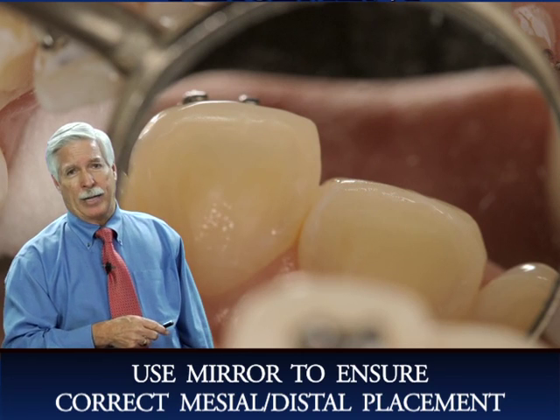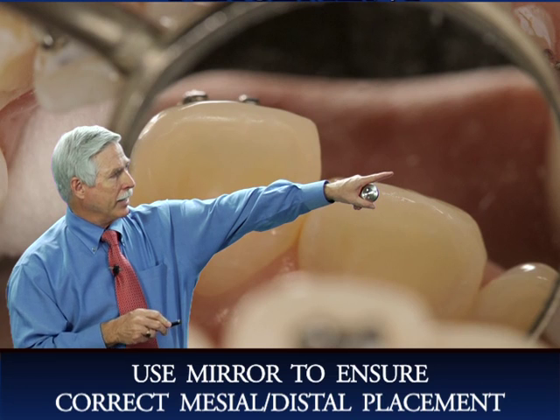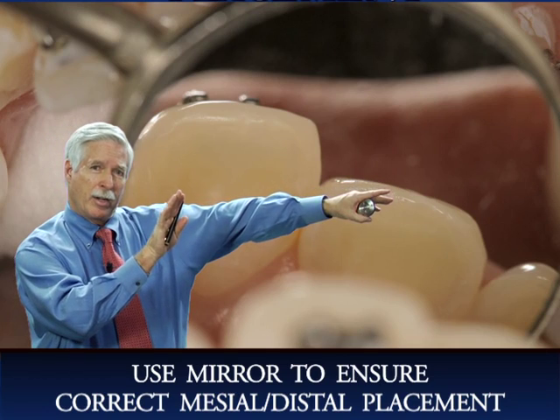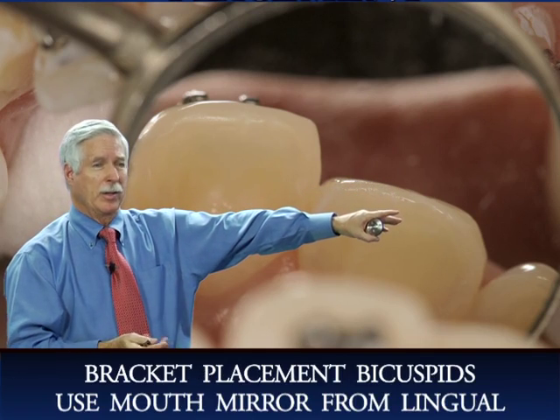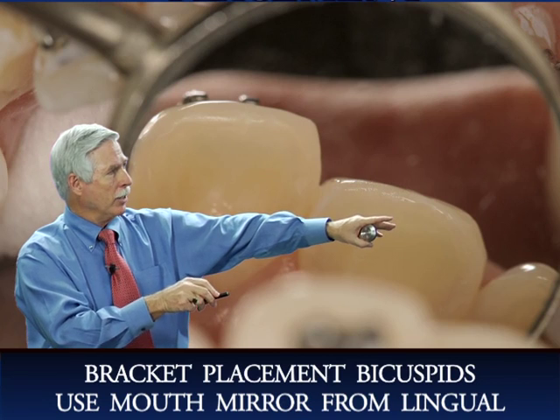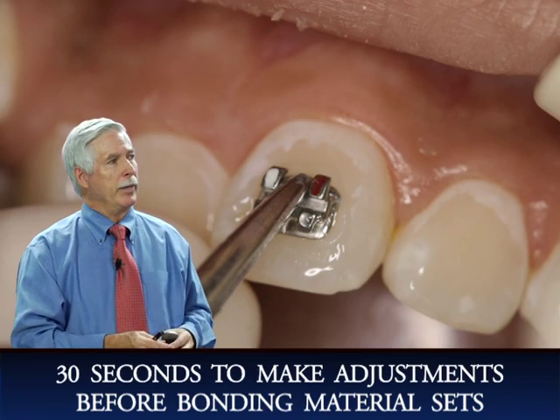When you're placing brackets, it's a good idea to take out your mouth mirror, as you see here, and just check to see if the bracket is lined up properly, if it's placed properly mesiodistally. Because sometimes, especially if the tooth is rotated, it's hard to see, and particularly in the bicuspids. I'm finding on bicuspids, you really have to use this mouth mirror to check the bracket position from the lingual. Now you have 30 seconds working time with these.